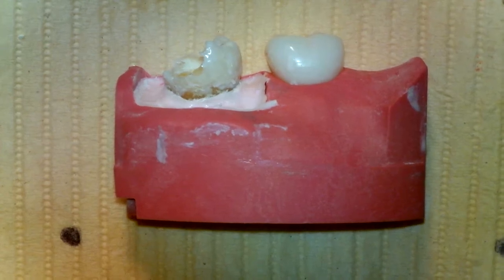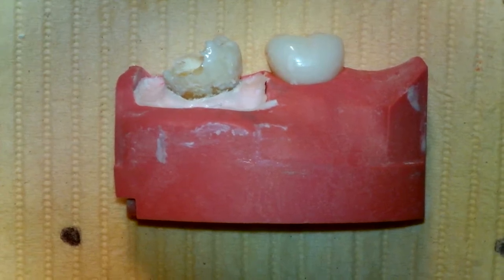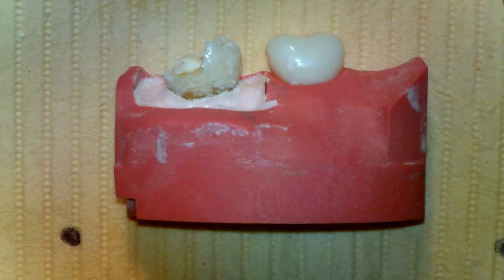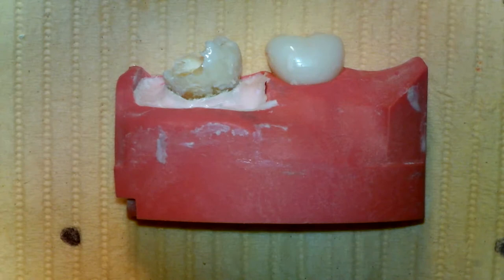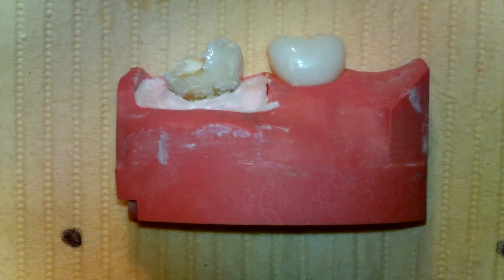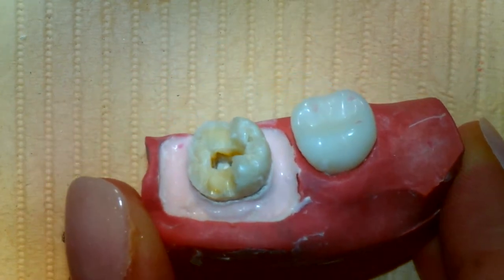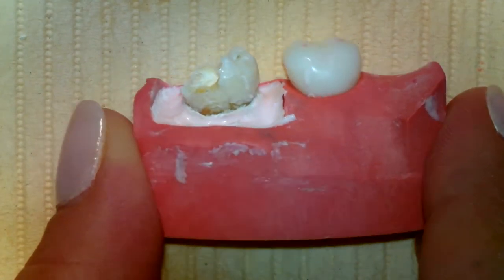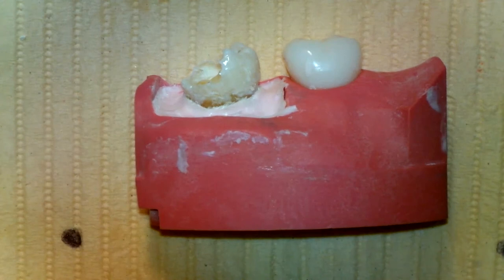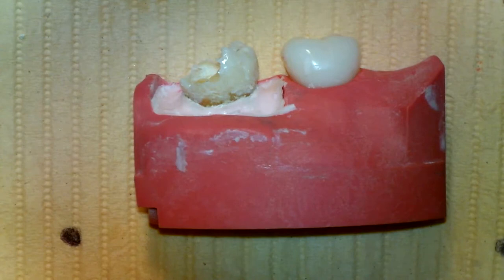I'm going to talk a little bit about the reasons for a post. The purpose of a post is for the retention of the core buildup. The post prevents the core from separating from the tooth. In this clinical situation, there are not enough walls remaining on the natural tooth to retain the core on its own. It needs the extra help to keep the core from dislodging from the tooth — thus the need for a post.